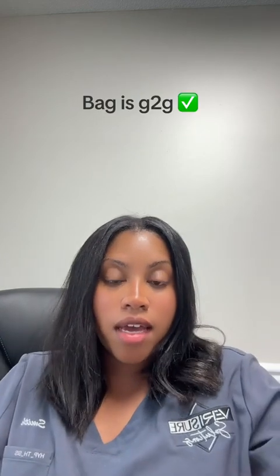So the barcode label is here. It's going to be this number right here, and that is how it's placed inside the bag, so that the barcode can be scanned once it gets to the lab testing facility. And then you're going to remove this seal and seal the bag completely, and then everything that's inside the bag is good to go.